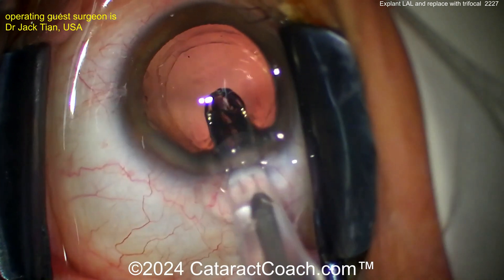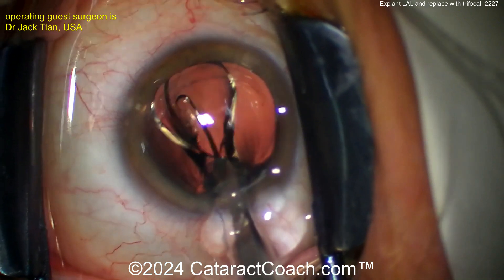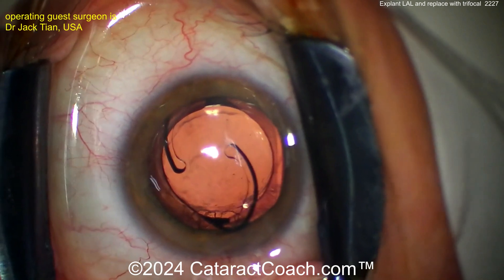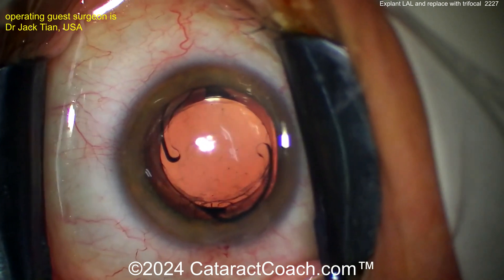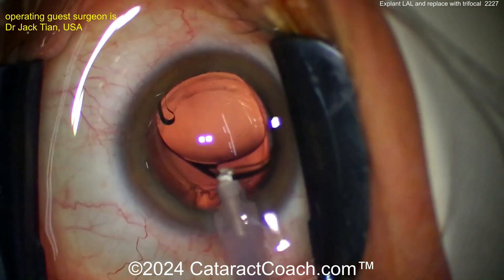Here comes the new lens going inside the eye. This is a trifocal single-piece acrylic lens. This trifocal lens has diffractive optics and is going to definitely give you that near vision, and as a result the patient's going to be happy with that. But I hope you told the patient that they may experience decreased contrast.